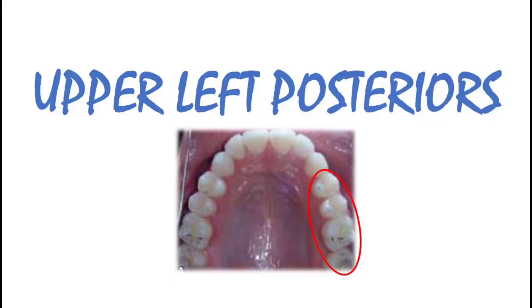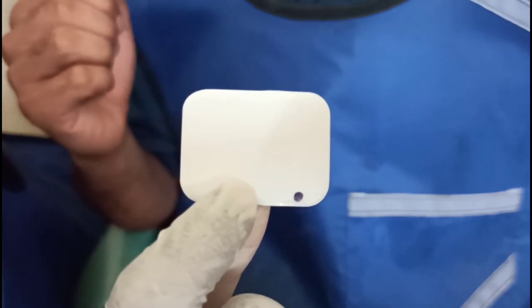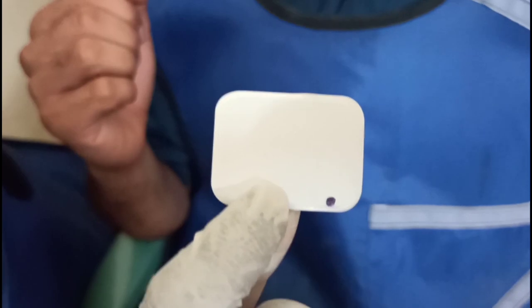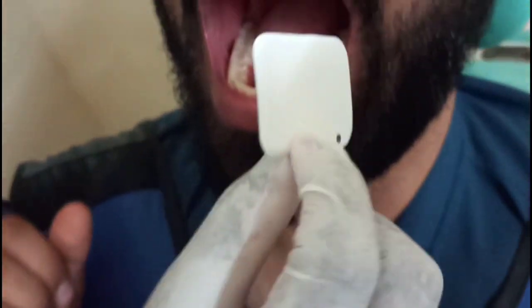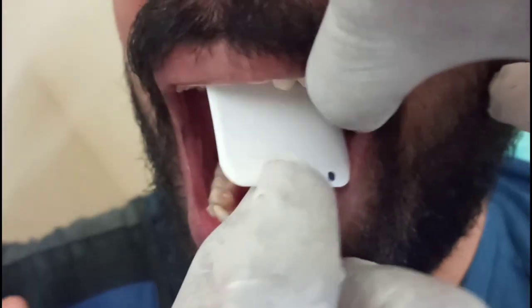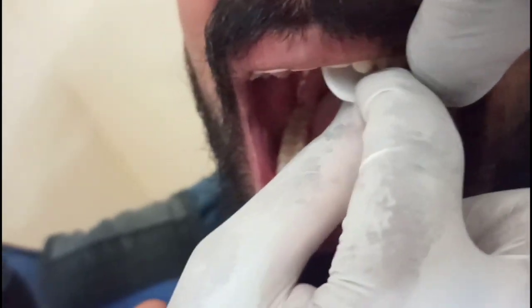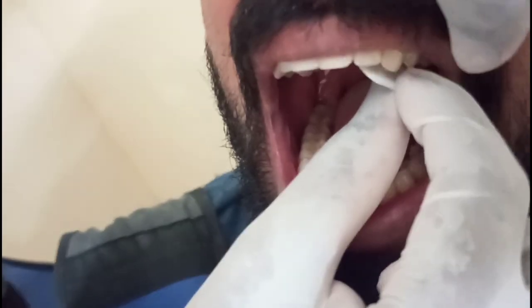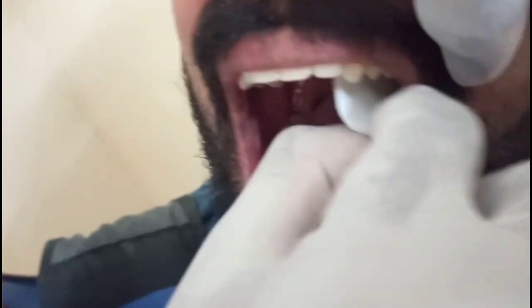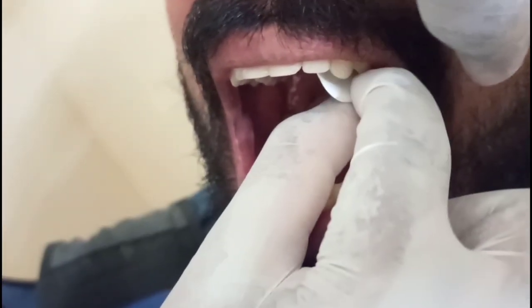Moving on to upper left posteriors: now we have to use our index finger for measuring and hit the index fingernail to the occlusal plane, ensuring the parallelism of the edge of the x-ray film to the occlusal plane.